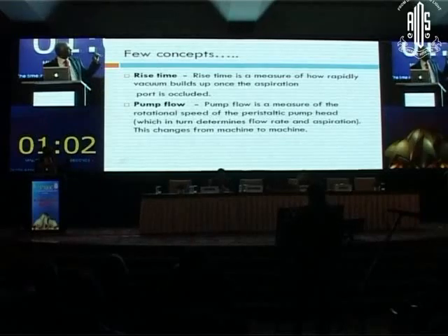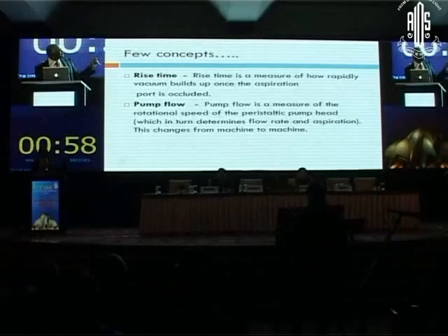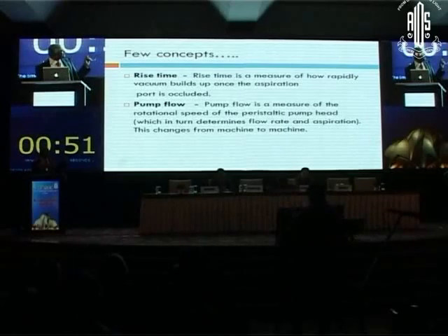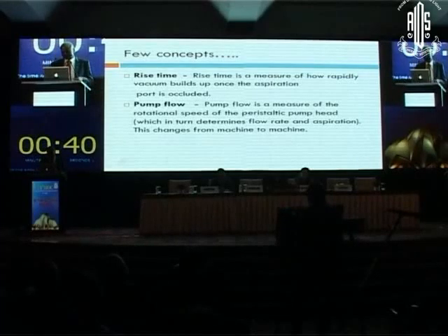Now rise time. The rise time is a measure of how rapidly the vacuum builds up once the aspiration port is occluded. The pump flow is a measure of the rotational speed of the peristaltic pump head, which in turn determines the flow rate and aspiration, and this changes from machine to machine.